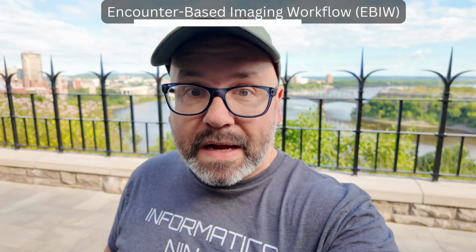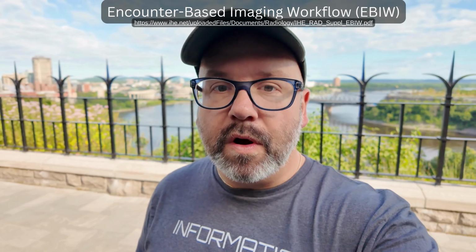So, encounter-based imaging workflow, or EBIW, gives us the means to do the entire style of radiology workflow for encounter-based imaging. This is really important when you think about, for example, when I'm going to capture dermatology images, let's say for a skin lesion. We don't think, as we capture an image, do I need to take an order? I write myself an order to acquire that image, I'm going to take that image, store it to a PACS, and write a report. A lot of these workflows don't make a ton of sense for encounter-based imaging when it's on demand.